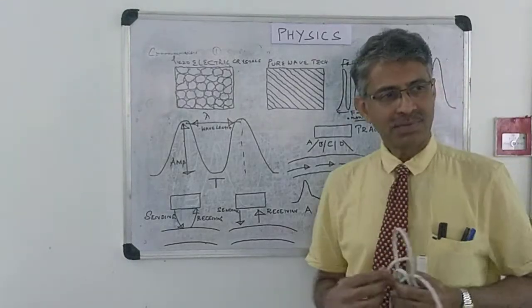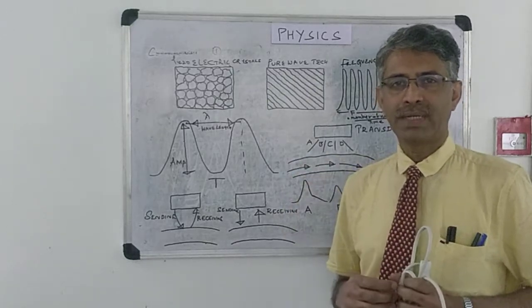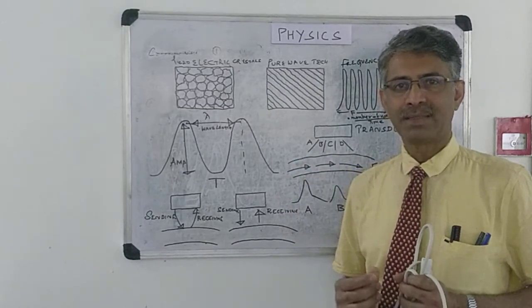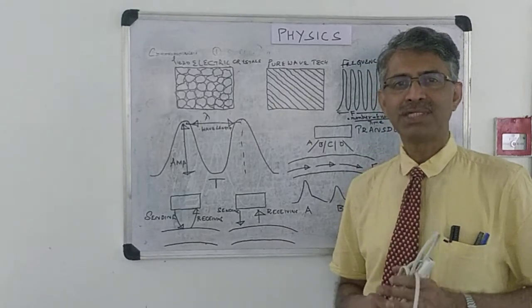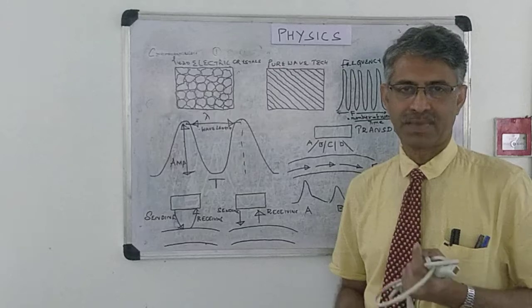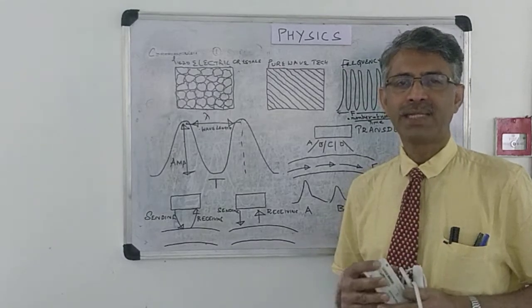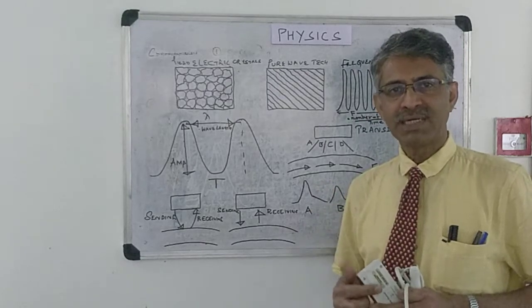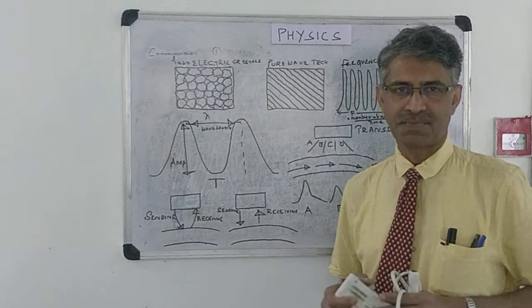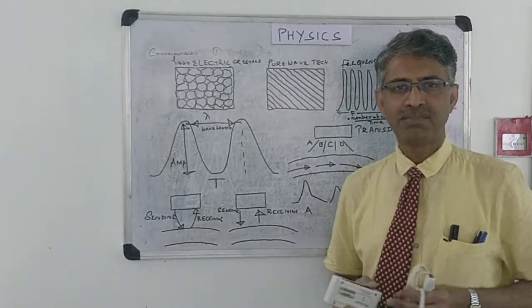We all know the sound is produced when energy is passing through any media like air, water, solid. It produces vibrations. This vibration is nothing but sound. The audible sound, the human hearing, is between 20 and 20,000 hertz, and anything beyond 20,000 hertz is called ultrasound.